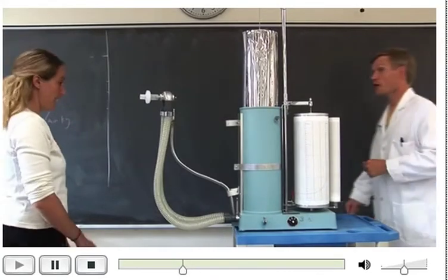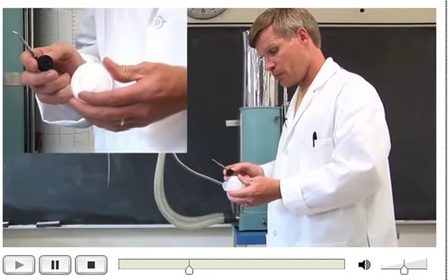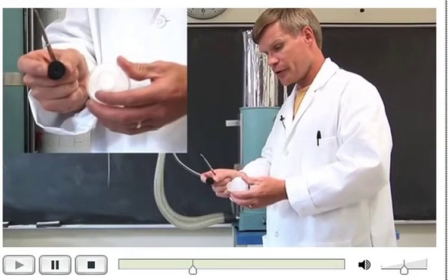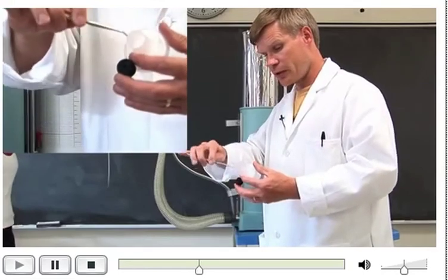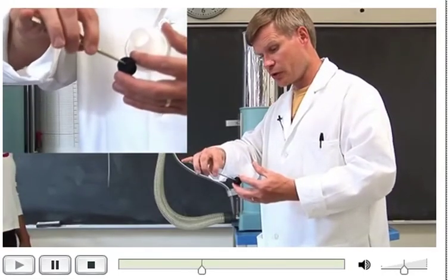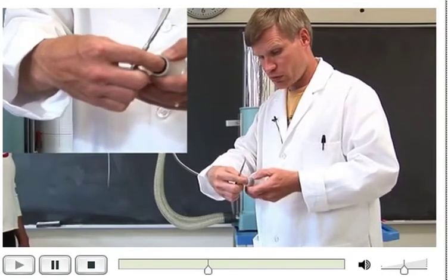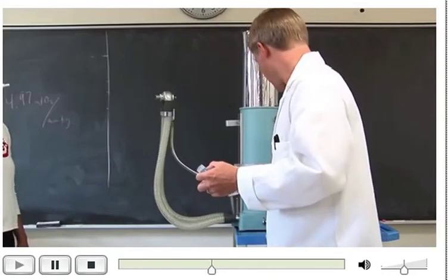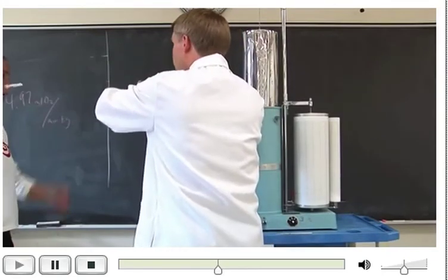I'm going to give you an obstruction now. Okay. So there's the mouthpiece that she breathes through. This is the obstruction. So air will be reduced to not this area, but this hole right here is what she'll be breathing through. So there's the obstruction. Most people do hate the obstruction.